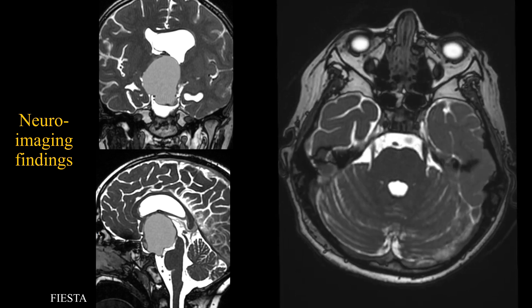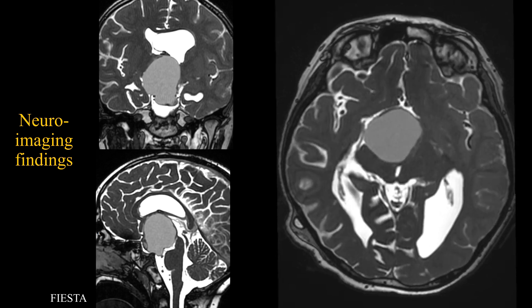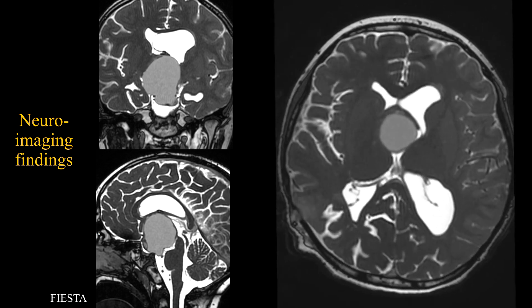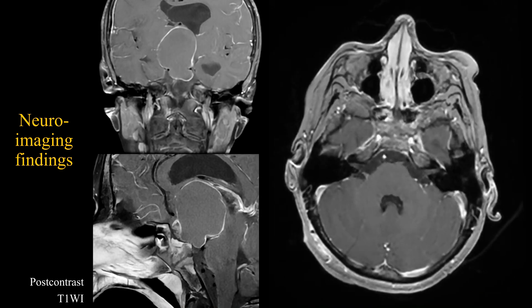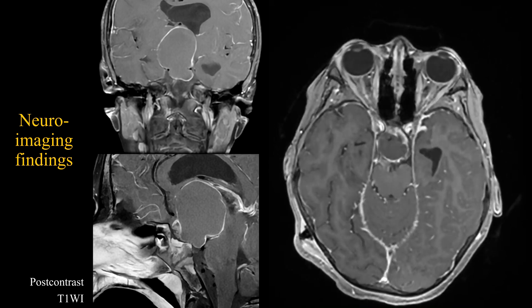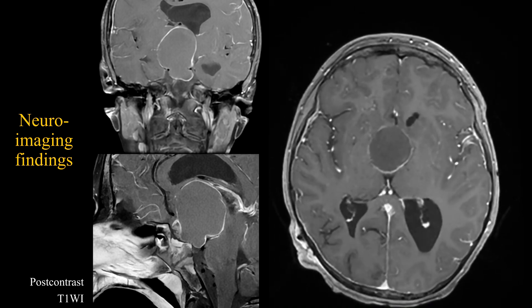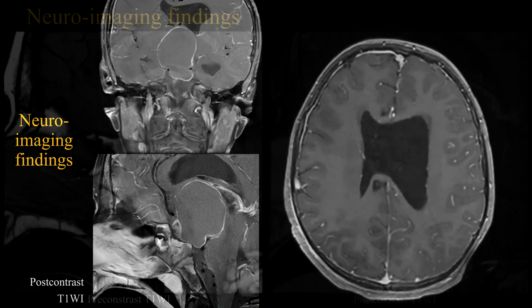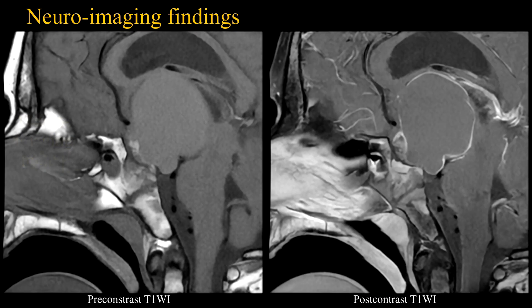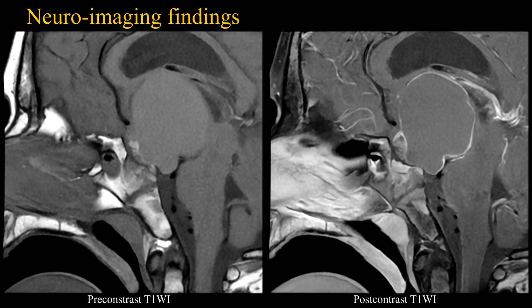MRI depicted a large solid-cystic mass with major suprasellar extension, obliteration of the third ventricle, and projections to the interpeduncular and prepontine cisterns. The lesion measures 4.5 by 3.6 by 3.3 cm in the greater axis, with greater extension to the right side. Peripheral enhancement after contrast administration is observed, as well as heterogeneous enhancement of a mural nodule located anteriorly and inferiorly.